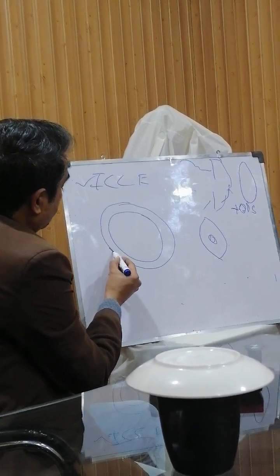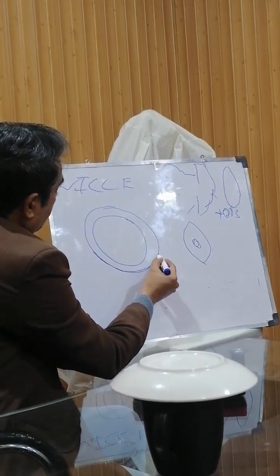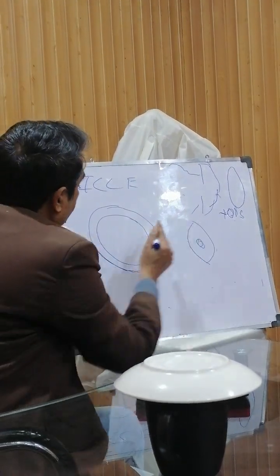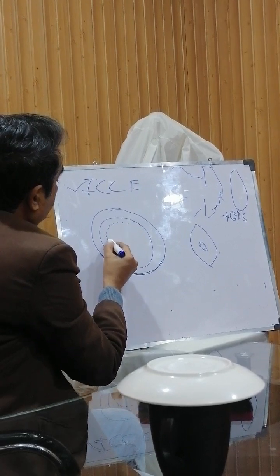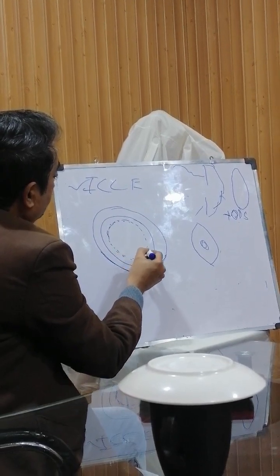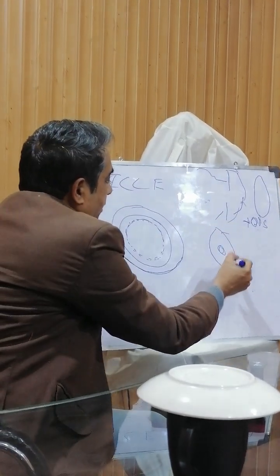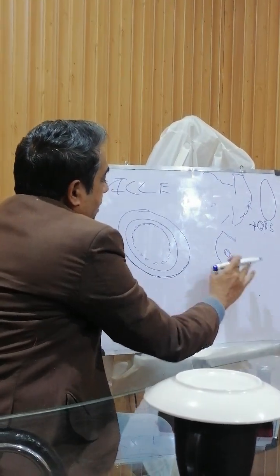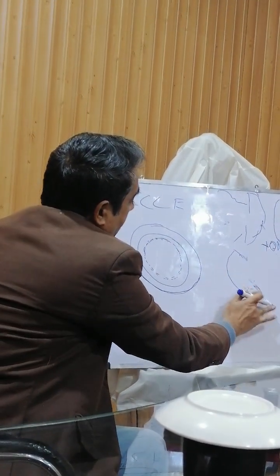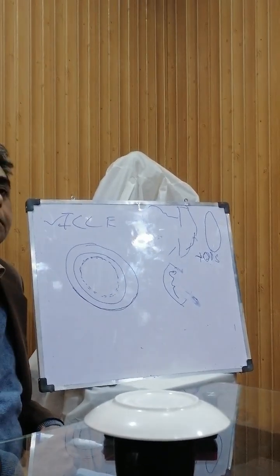From 2 o'clock, for example, to 10 o'clock at the limbus, a long incision, and the whole of the lens is taken. This is the anterior capsule. It is opened, called can opening anterior capsulotomy. Anterior capsule is removed first of all. Okay. Then by applying pressure, nucleus is removed. Now we are left with cortex and posterior capsule. Posterior capsule is not removed.